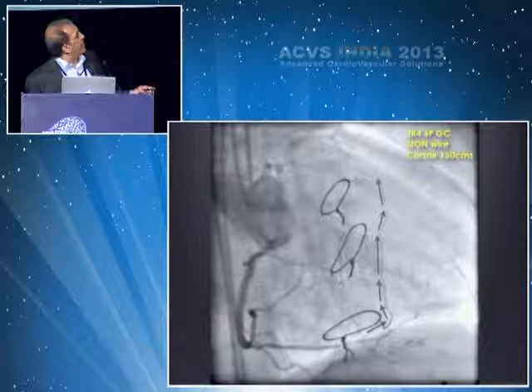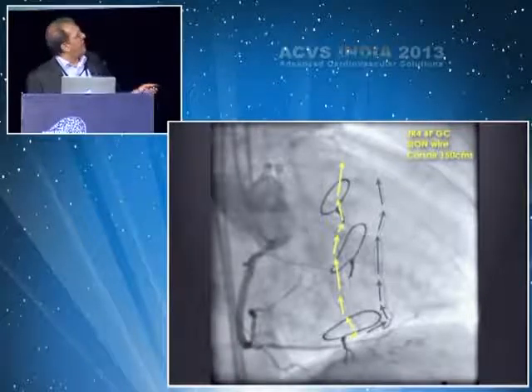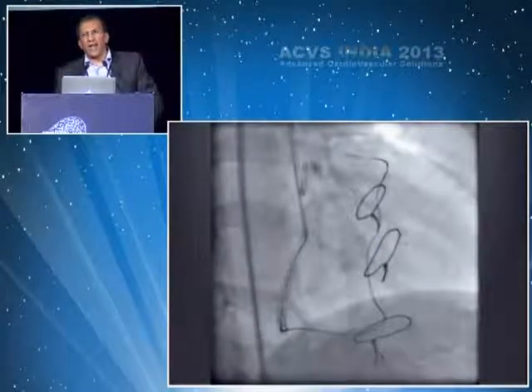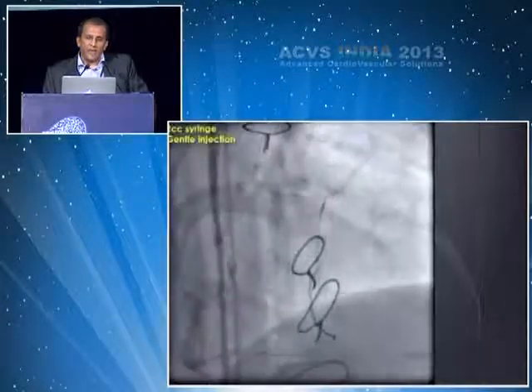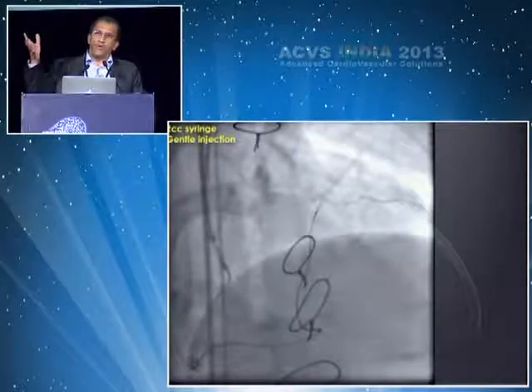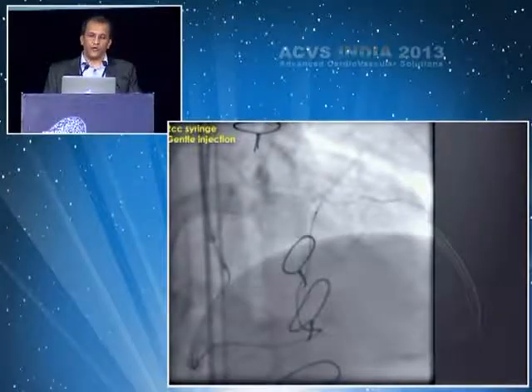We had 2 over here, 1 here and 1 in the yellow. And we realized that if we use the yellow, which is more proximal, that's my favored approach. And so we took a Sion wire, and we had an access with a Corsair into this retrograde system. Once we had this, we take a tip injection to make sure that you have your orientation of the occluded artery distally, so that you can decide and change your wire positions over here if you need to.